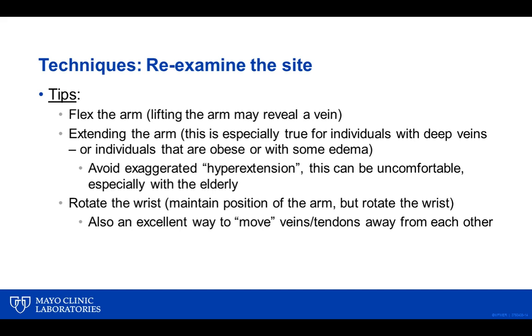But finding that cephalic vein is quite easy in the wrist area, and then move either down or above from the actual wrist area to make the venipuncture. Thank you for that point that we didn't clarify.